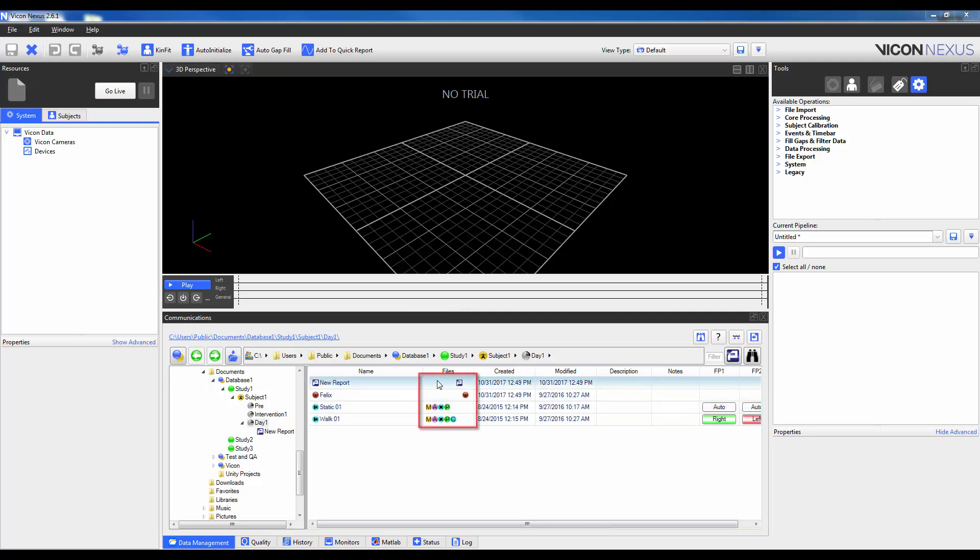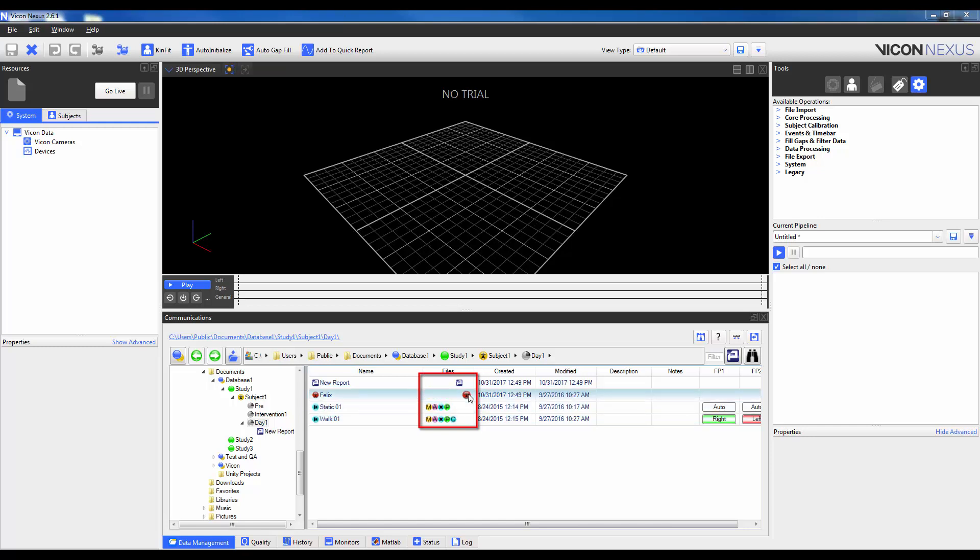Within the Files column, we can see different icons to denote what file types are associated with each trial. Moving from left to right, we can see that WOC01 has a movie or AVI file. It has analog data, it has 2D camera data, it has a C3D, and a CSV or text file has been exported. We can also see the subject and polygon report icons have been duplicated in this column as well. Managing these files and their corresponding file types will be covered in a subsequent video.